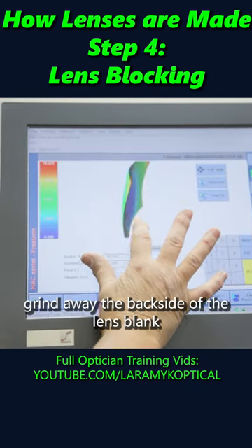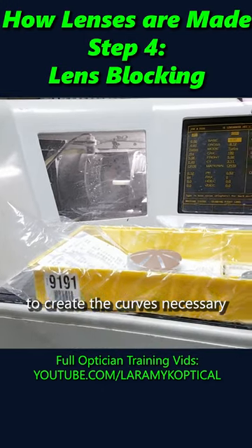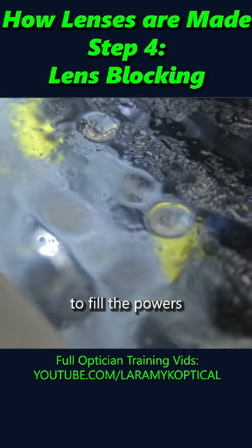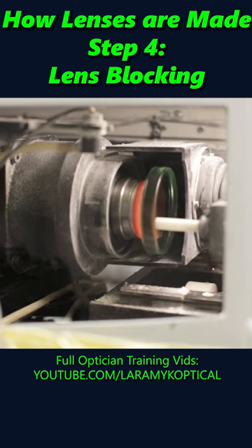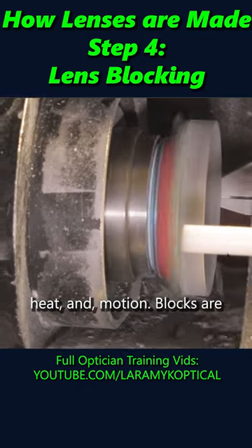We are about to literally grind away the back side of the lens blank to create the curves necessary to fill the powers that match the prescription ordered. That grinding process requires a lot of force, heat, and motion.